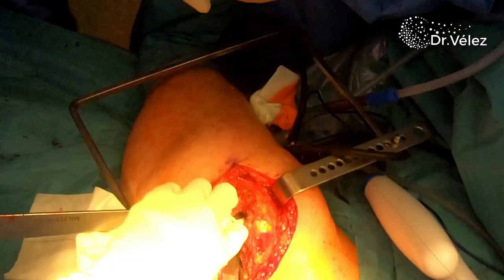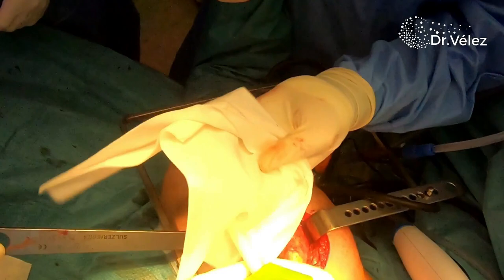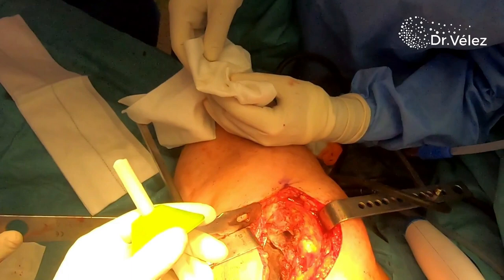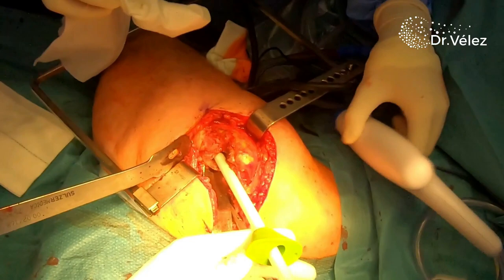After we have correctly cleaned out the femoral canal and it is correctly prepared for cementation, we have also prepared the cement within the cement gun. We follow the instructions according to the cement that we're going to use. We tend to use cement with gentamicin in these types of cases. And when the cement is optimal for implantation, we introduce the cement within the femoral canal. After this, we then proceed to implant the selected prosthesis and wait for the cement to harden.